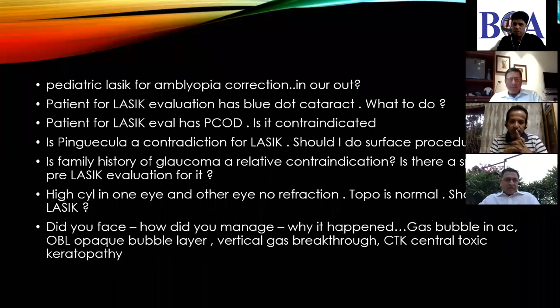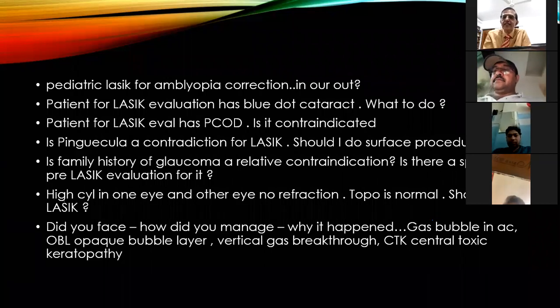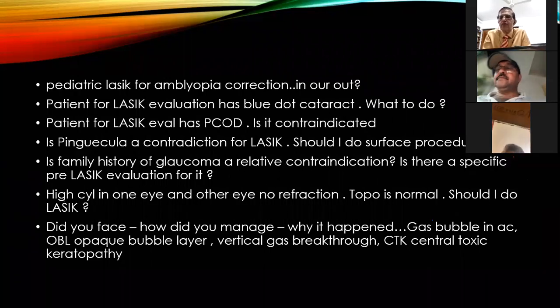In fact, you'll be surprised. There's a surgeon with one of the largest refractive practices in India. When I was in his OT once, when he does a multifocal, he takes a keratome flap first in both the eyes, puts in the multifocal, because invariably you never get 0-0. Then he just does a little touch-up after a few weeks, and he has a very happy patient. So let's take everybody's opinion on this, post-cataract LASIK.